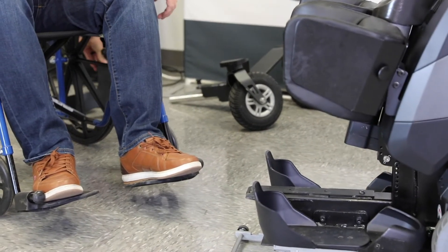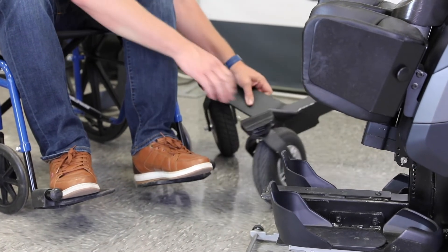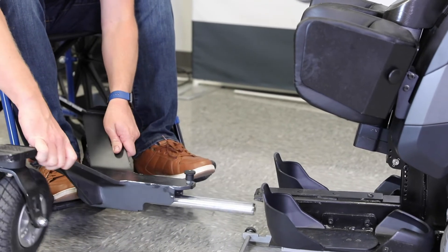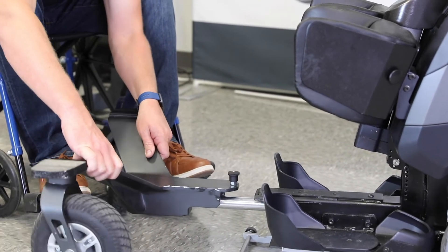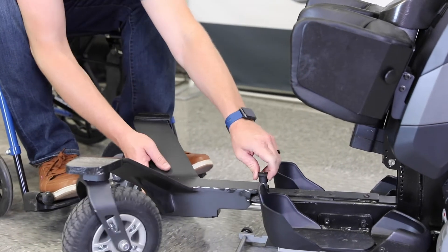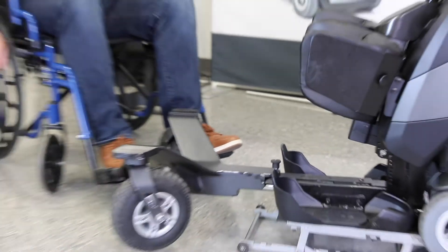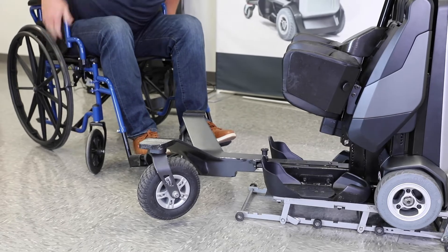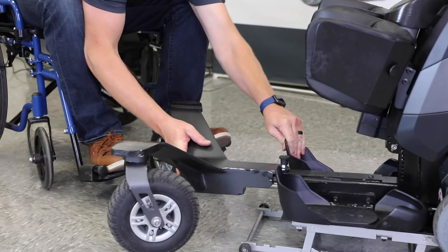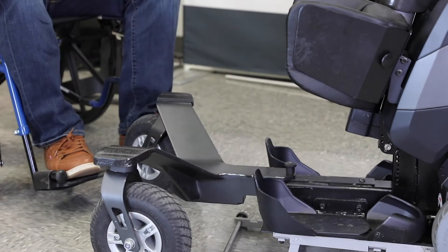Put that out of the way, and then I'm going to grab the outdoor tail piece, and it's going to slide in much the same way that I just pulled that one out. Lift up on that pin, lift up on this pin, and slide it in, and it'll lock into place.